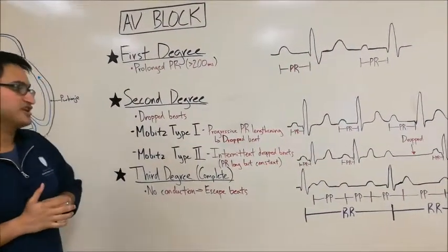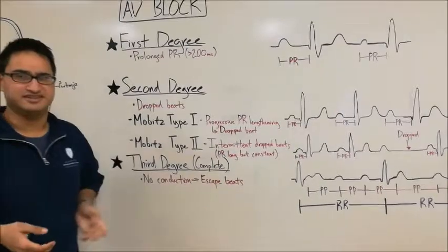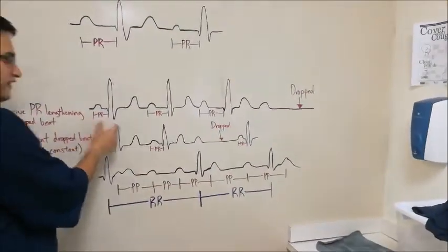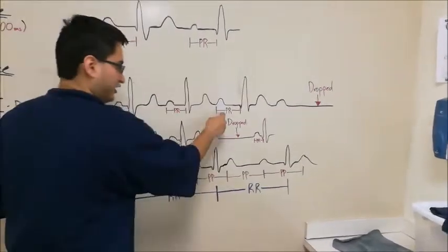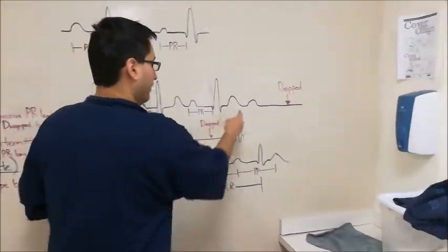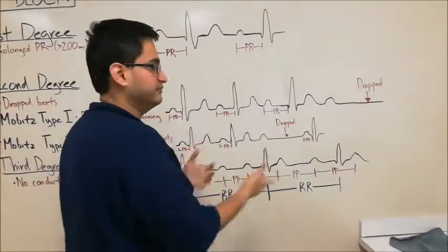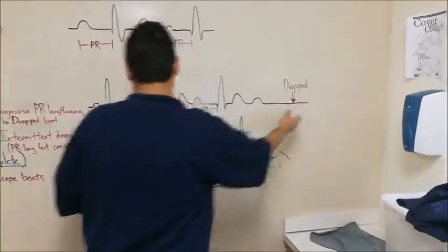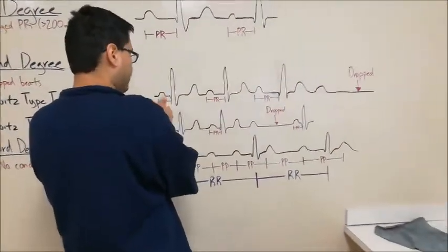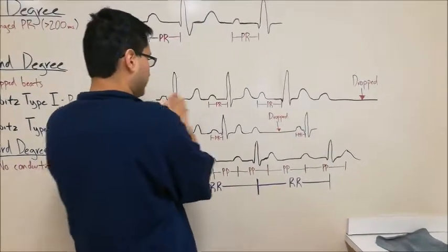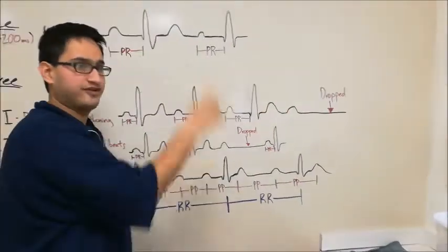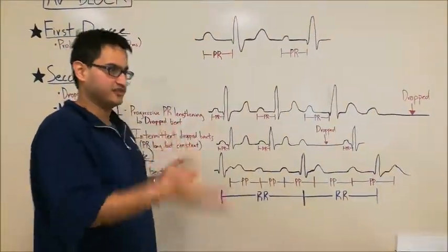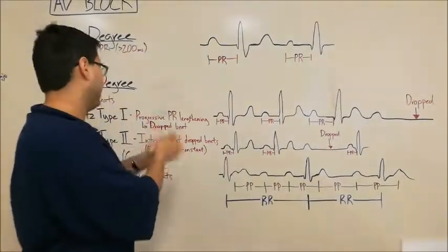In Mobitz type 1, we have progressive PR lengthening and then a drop beat. So let's take a look at this EKG here. We have this PR interval, we then have this PR interval, this is longer than that. And then this is longer than that. And then, boom, a dropped QRS complex. That's a dropped beat. The ventricle did not contract. Now after this, it would reset similar to this where you have a PR that's long but not too long, and then a longer one, and then a longer one, and then a repeat again. So it follows a very cyclic pattern. So if you see that cyclic pattern of prolonging PRs, then a drop beat, and then it starts all over again, that's Mobitz type 1, also called Wenckebach.